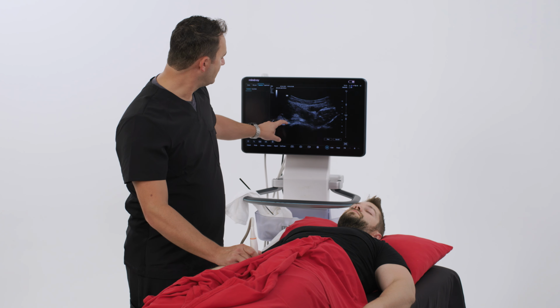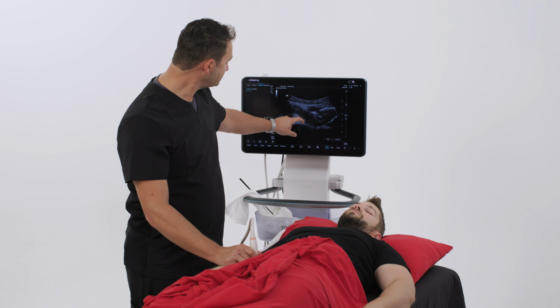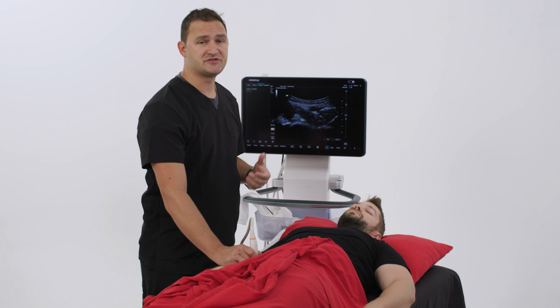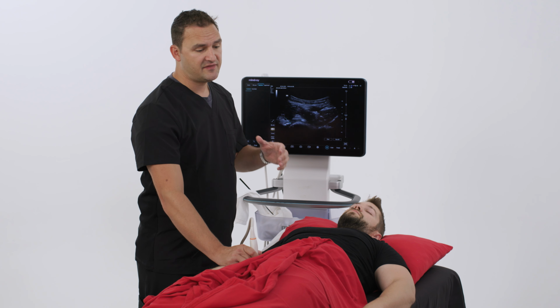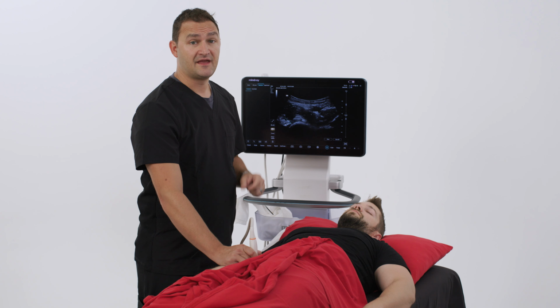And if you inject there, it will ride over the muscle or over the bony structures here and get the articular branches of the femoral nerve and the articular branches of the obturator nerve. These are those branches that will terminate on the greater trochanter of the femur and thereby get great analgesia to the hip. Fantastic block for hip arthroplasties or proximal femur fractures, such as a femoral neck fracture or intertrochanteric fracture. This is the block of choice for that. It gets great analgesia for that. This is the PENG block.